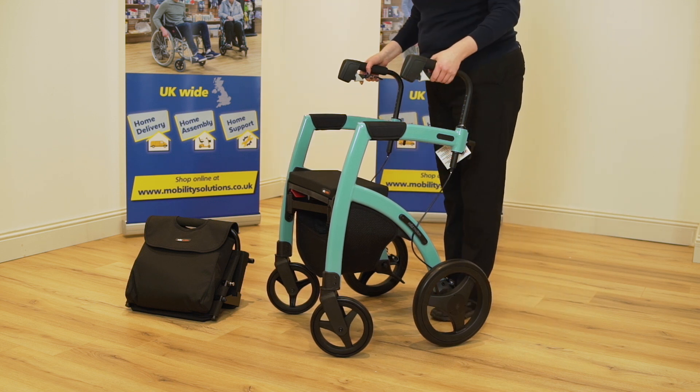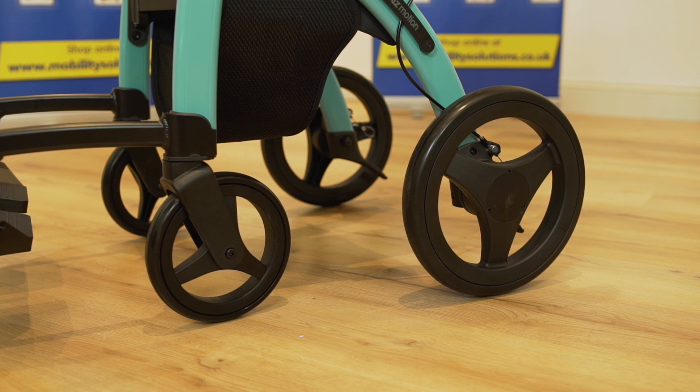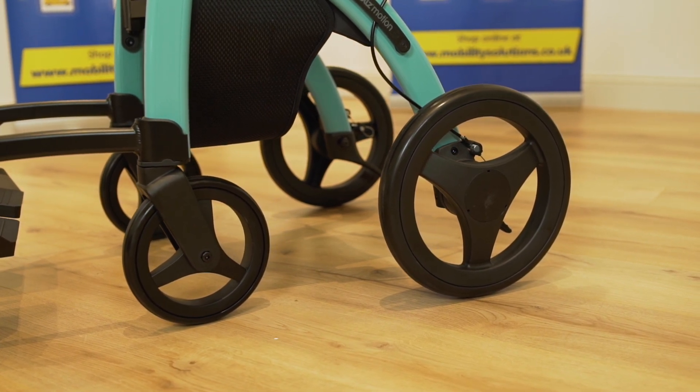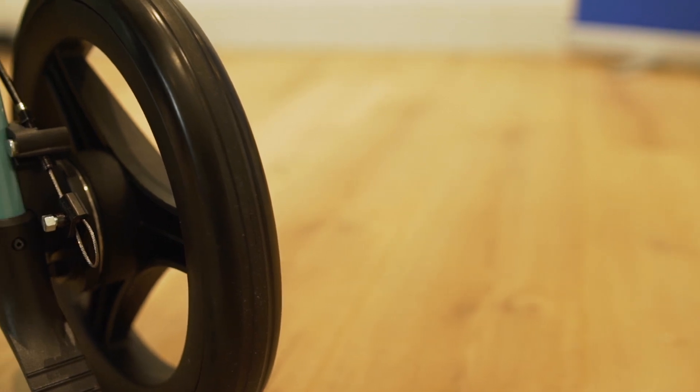The redesigned wheels on the Rolls Motion 2 allow it to tackle a range of terrain. The seven-inch front wheels allow great maneuverability and the larger 12-inch wheels at the rear ensure a comfortable drive. The Rolls Motion 2 boasts an easy-to-use and secure braking system, with innovative drum brakes ensuring safe and balanced braking.